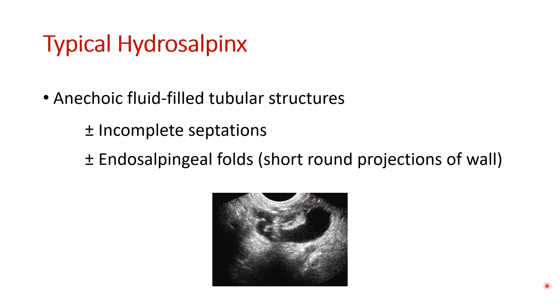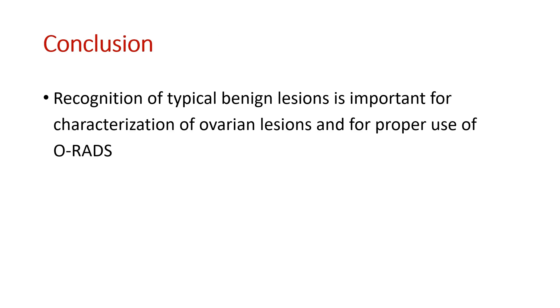A typical hydrosalpinx is anechoic with a tubular structure, like this enlarged fallopian tube filled with fluid. In conclusion, recognition of typical benign lesions is important for characterization of ovarian lesions and for proper use of ORADS. Thank you for listening.